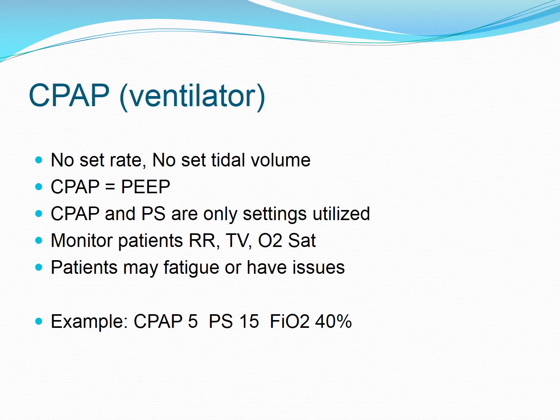So basically, this is usually done in the mornings, and we don't have any set rate or any set tidal volume with PEEP because these are spontaneous breaths. So basically, we just have that continuous positive airway pressure, which is all the time. And then we can also add a little bit of pressure support when they take that breath to try to get that bigger tidal volume.